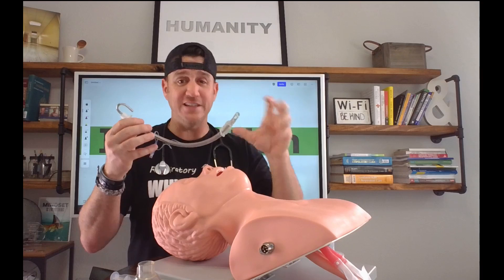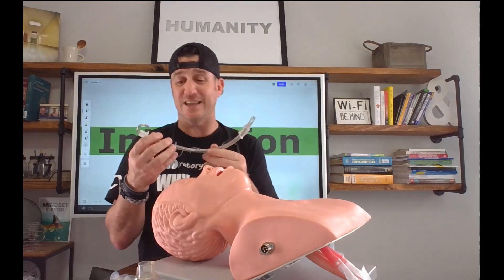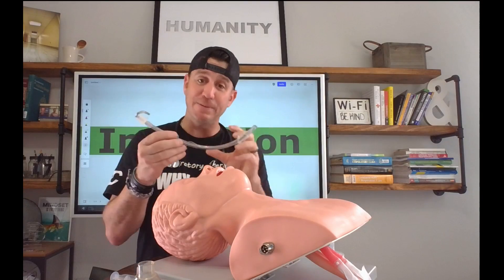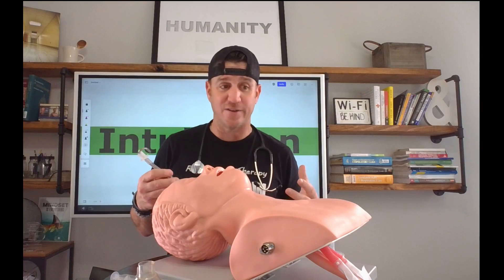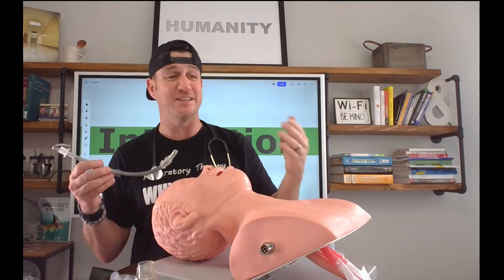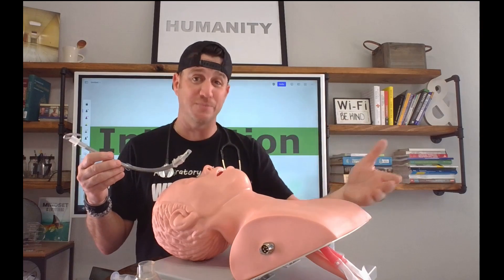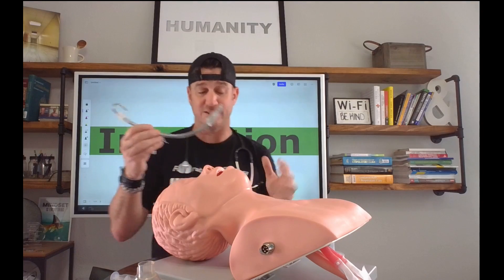Some people curve these slightly different ways — that's kind of preference-based. The other thing is you would likely be manipulating the stylet in the endotracheal tube while it was still in the package so that this all stays clean. We don't want our dirty hands introducing the bugs that are floating around — we don't want this to be dirty when we put it into our patient, because if it is, it's going to be associated with a high risk of ventilator-associated pneumonia. So we want to keep this as clean and as sterile as possible prior to the intubation phase. Keep it in the package as long as possible.